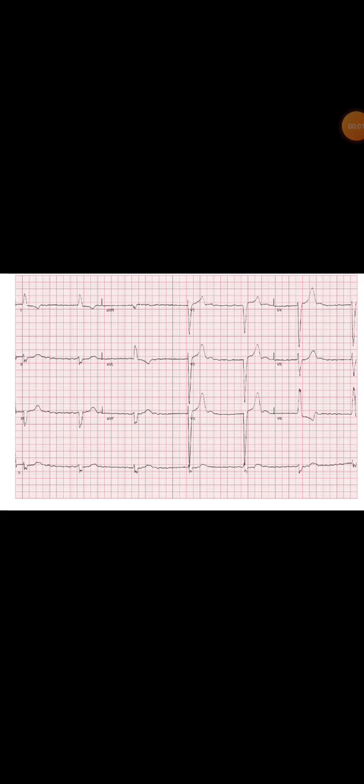We'll discuss this 12-lead ECG. Starting with the heart rate calculation, which is almost 38 beats per minute. Then looking at the axis using lead 1 and AVF, that is left axis deviation.